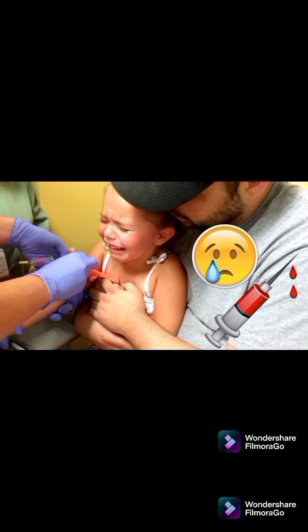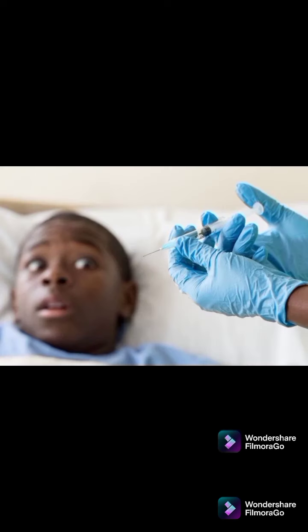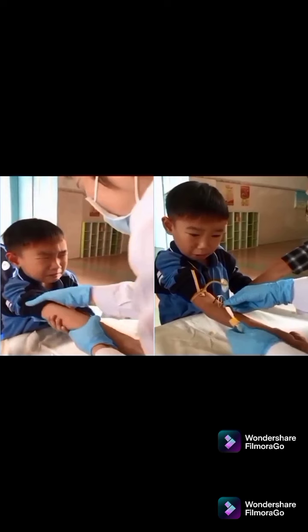For pediatric venipuncture, children may be sensitive to pain and have a fear of needles, or what is known as needle phobia. One way to gain that child's trust is by physically lowering yourself to the child's level and explaining the procedure to them. It's important to also calm a crying child down as soon as possible because the stress of crying can alter blood components and lead to erroneous test results.